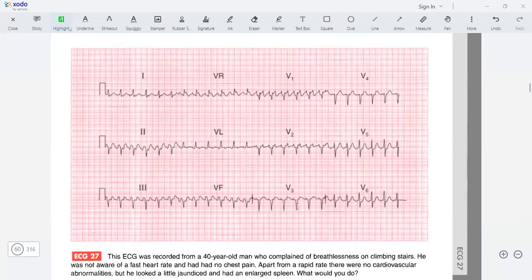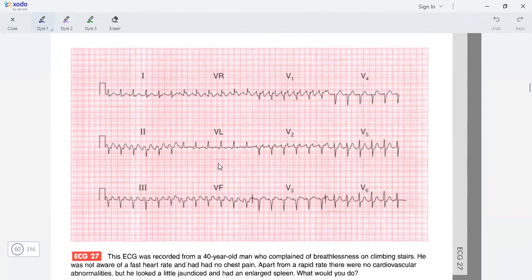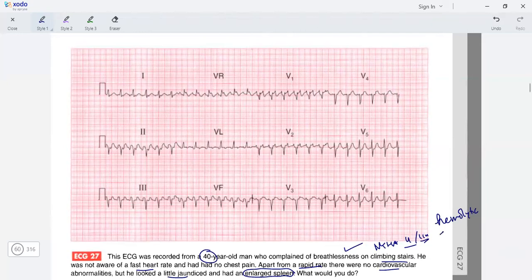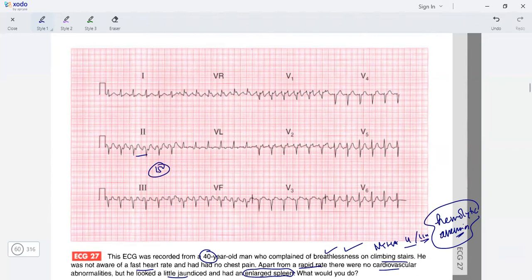This is probably our last case. A 40-year-old man with shortness of breath on climbing stairs, could be NYHA 2 or 3. He was not aware of a fast heart rate and had no chest pain. There were no cardiovascular abnormalities, but he looked a little jaundiced and had an enlarged spleen. Little jaundiced and enlarged spleen - is it a hemolytic anemia? I suspect this could be hemolytic anemia from this history. The rate is fast, around 150. The rhythm is regular, but look at the morphology of the P waves. Doesn't it look like a sawtooth? There are sawtooth-like P waves.